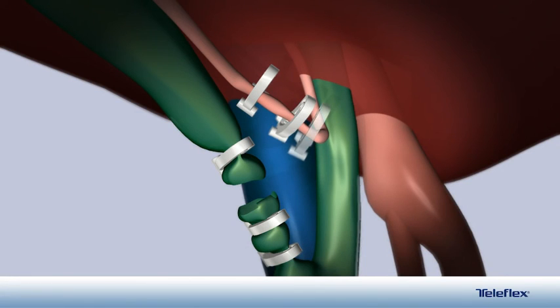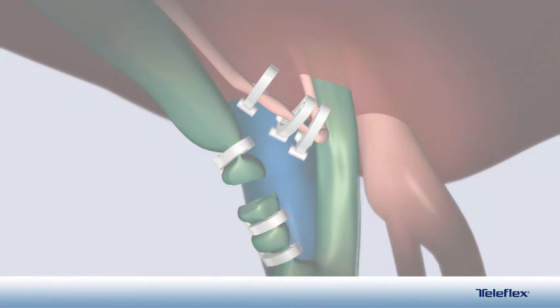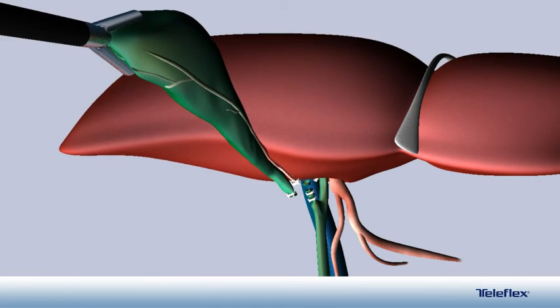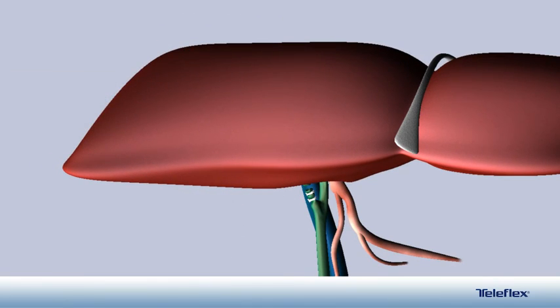The same technique is repeated for the cystic artery. The gallbladder is freed from the liver bed and removed in normal fashion.